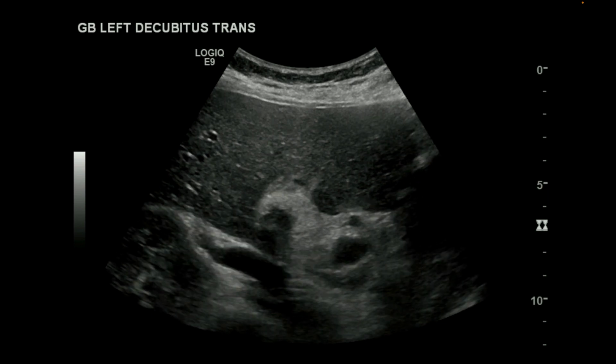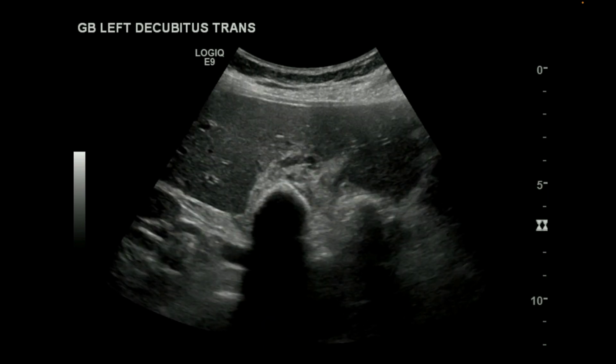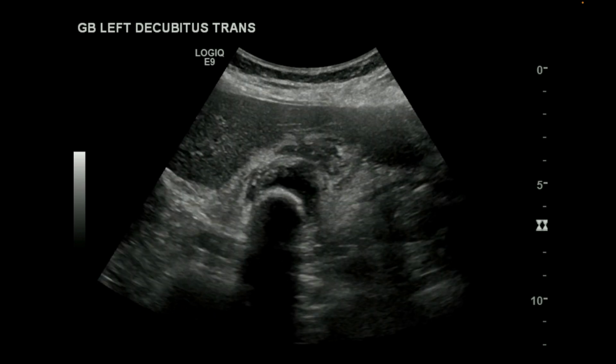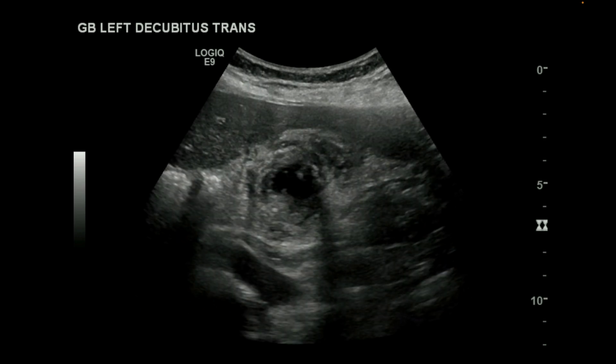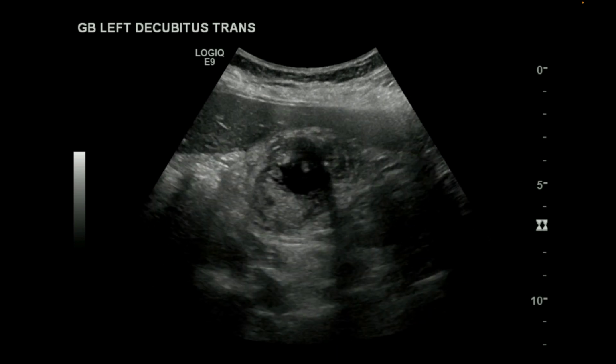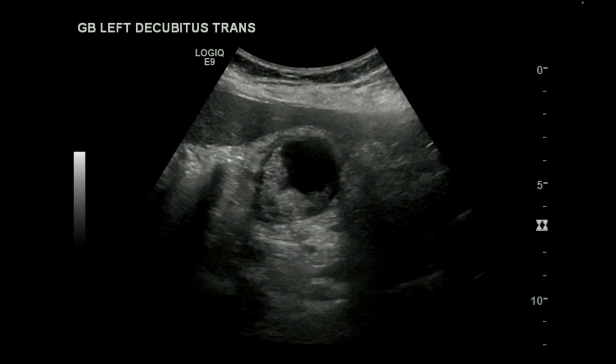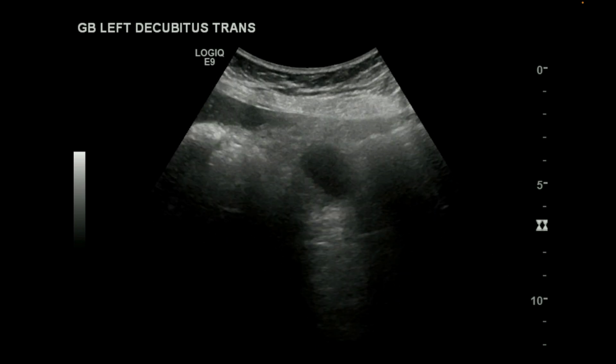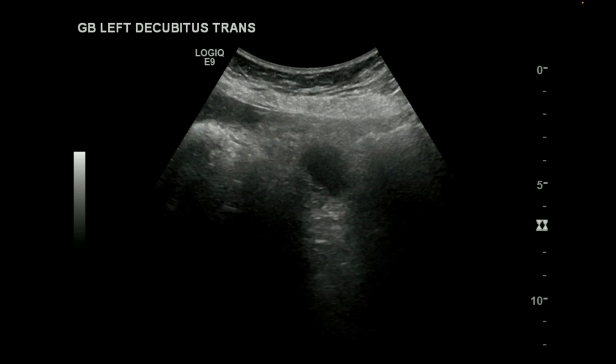Just about spaced repetition, once again, here's a gallbladder, and there's a stone in the neck of the gallbladder. And as we track up towards the fundus of the gallbladder, you can see that the wall is really broken down. It's really hard to work out exactly where the wall is. So this is a patient with cholecystitis that probably has signs of a rupture going on there, with some fluid outside the lumen of the gallbladder.